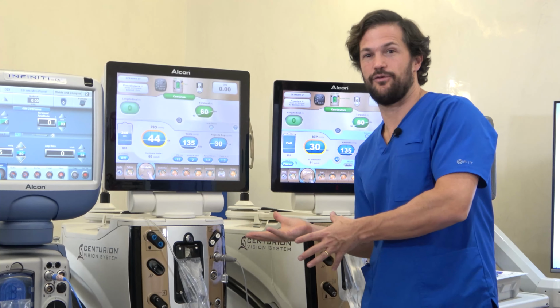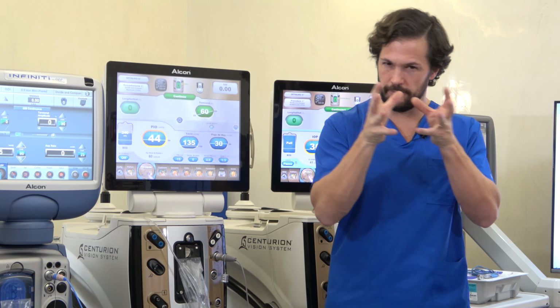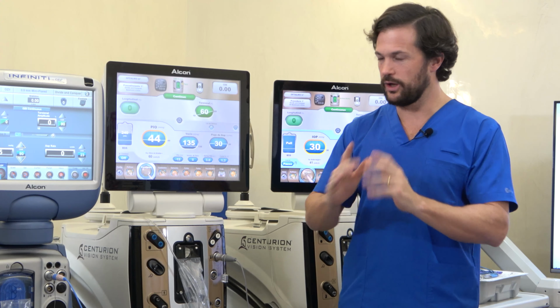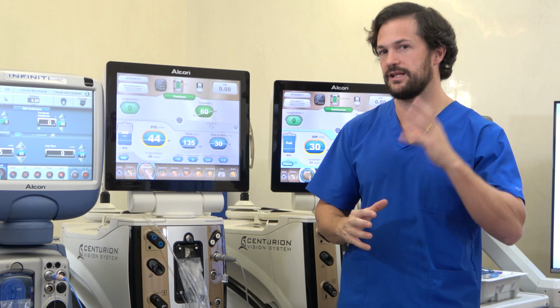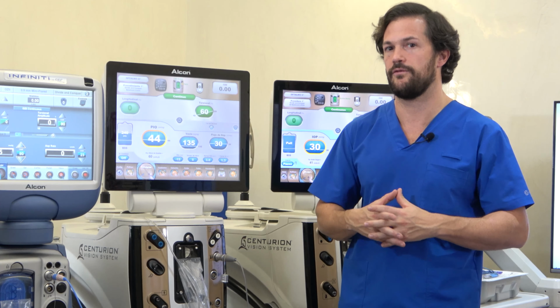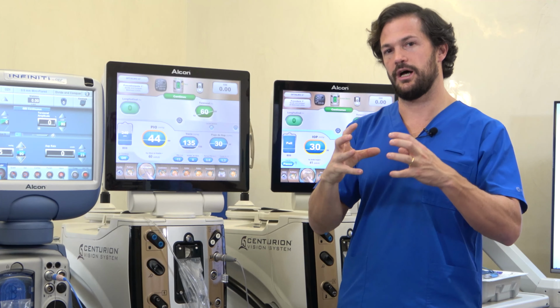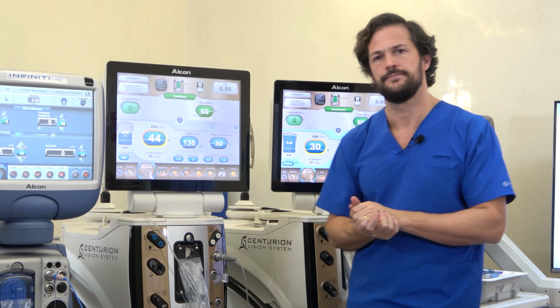So what Active Fluidics gave us is control. The focus became the anterior chamber. We are doing everything we can to have a stable IOP in the anterior chamber. Think about that. That's very important from the point of view of fluidics. And it allowed us to have a lot of stability, but with lower IOPs. Ale? Yeah, I agree with you.